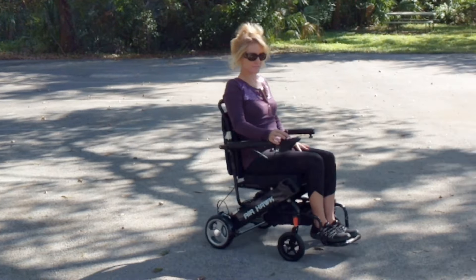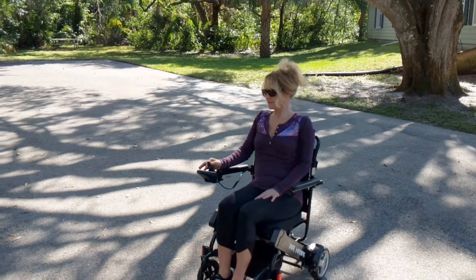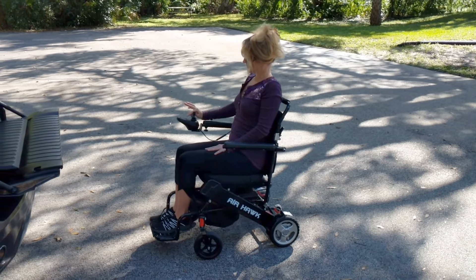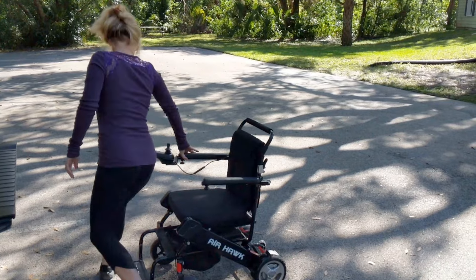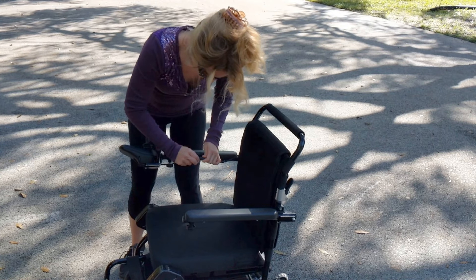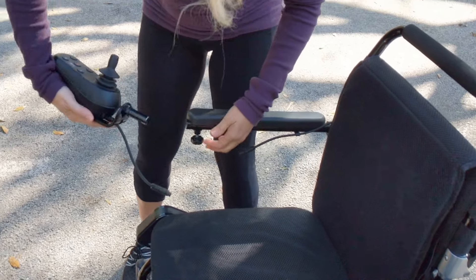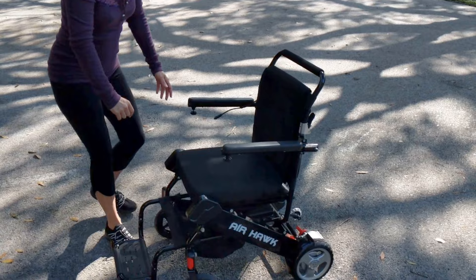Does what you want with just a simple control of a single finger. And now we're going to watch a petite female fold the chair up and put the chair into the back of a high sport utility vehicle. Just as easy as it was to attach the joystick, the joystick comes off. Disengaging the safety mechanism, taking the joystick off, and putting the joystick away.